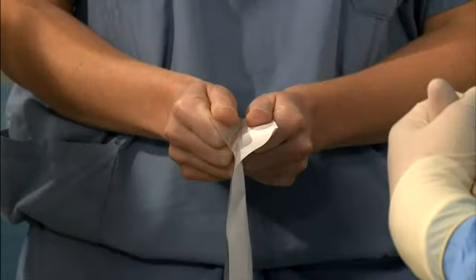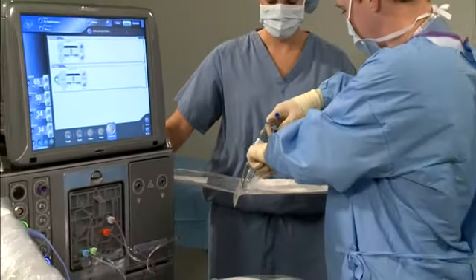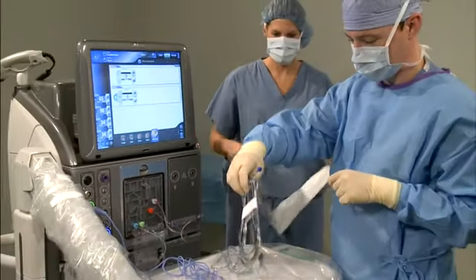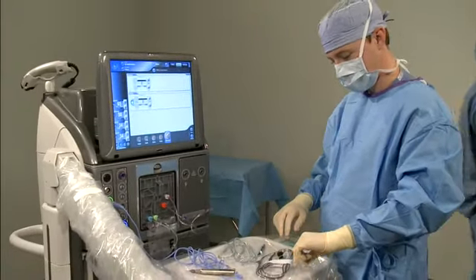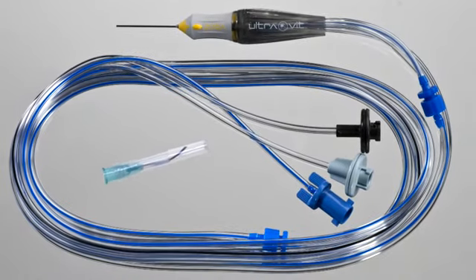After scanning, peel apart the pack and aseptically transfer the components to the sterile field. The anterior vitrectomy pack consists of one anterior vitrectomy handpiece with associated lines and connectors, and one irrigation cannula.